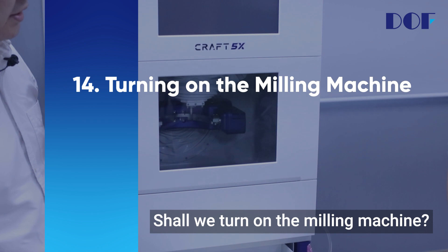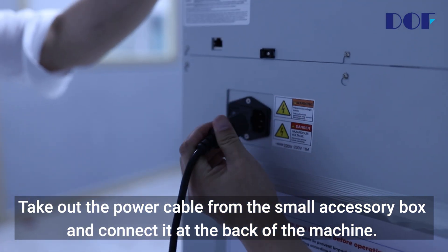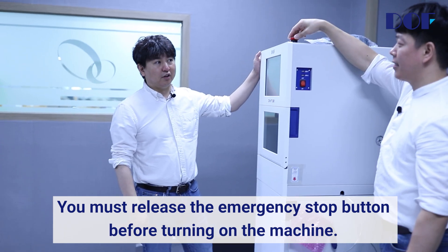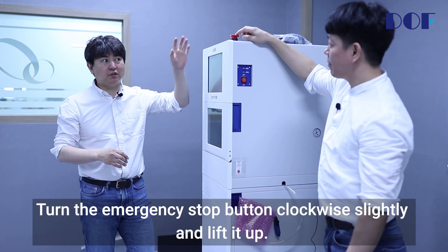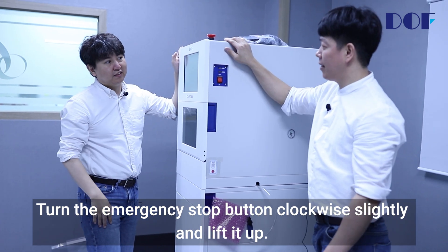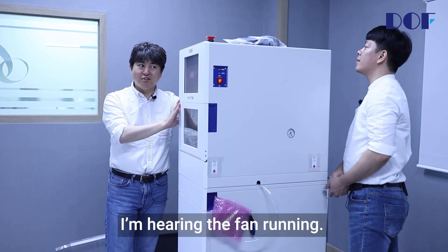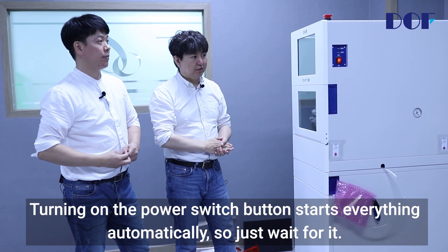Turning on the milling machine — shall we turn it on? Take out the power cable from the small accessory box and connect it at the back of the machine. After plugging it into an outlet, switch on the button. You must release the emergency stop button before turning on the machine. Turn the emergency stop button clockwise slightly and lift it up. Let's finally turn on the milling machine — I'm hearing the fan running. Motion app is automatically executed; turning on the power switch starts everything automatically, so just wait for it.